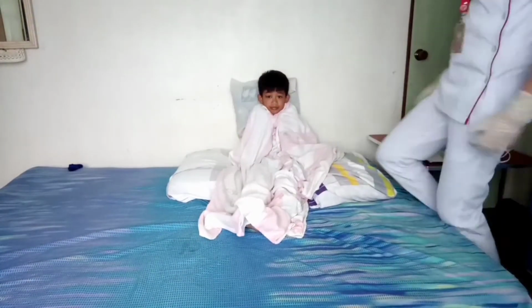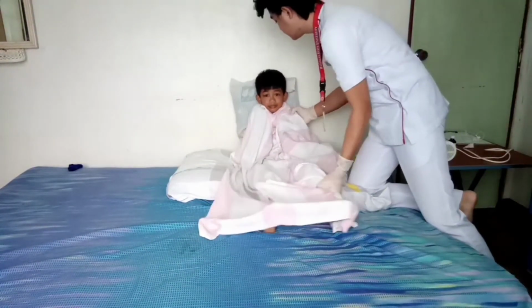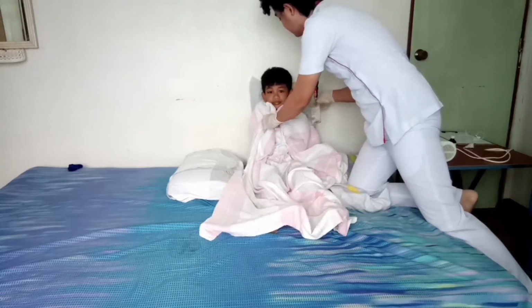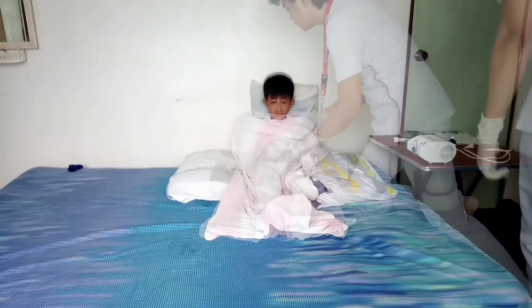And then place the patient in a comfortable sitting or semi-Fowler's position. This is to improve the lung expansion and medication distribution.